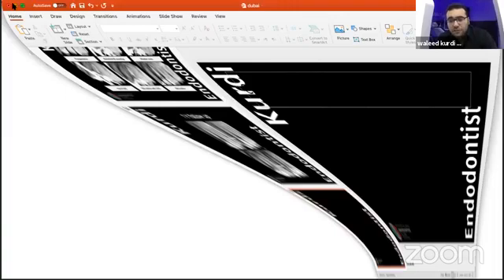How can I control bypassing beyond the curve from the inner surface, not the outer, and make sure strip perforation doesn't occur? Nothing here is absolute, but once you gain a catch with D-Finder number 10, you make an X-ray. Indeed, if you are bypassing from the inner curve, it will be easier because the broken file will just direct the bypassing file to the right apex.